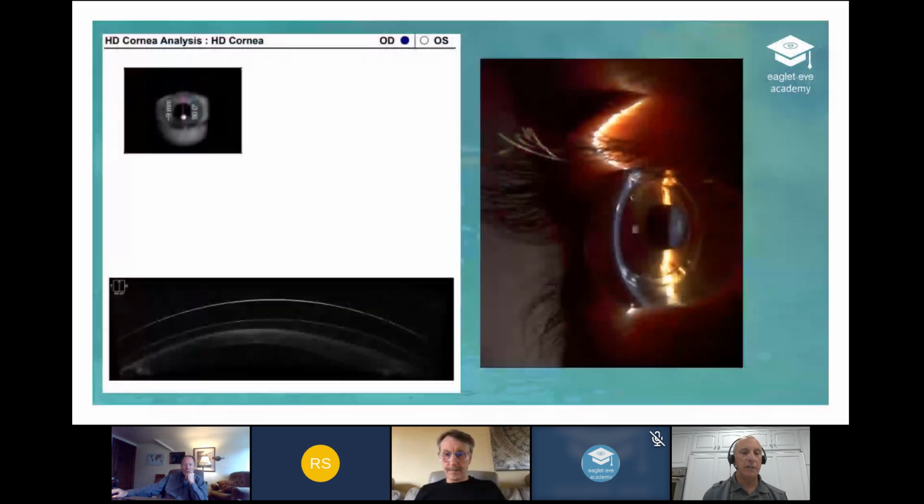Here's the OCT that was used to check. Also in the microscope, it might be hard to tell in there. You can see your lens intact, but you can actually see the front surface of the lens, the back surface of the lens, the spacing between the cornea, and judge your sagittal depth and your edges, just like always. I still always want to trust as the doctor to make sure it's fitting and it's going to be healthy and physiologically healthy for the eyes.